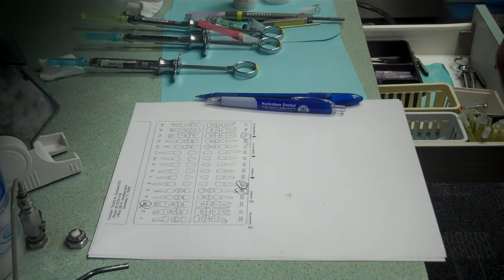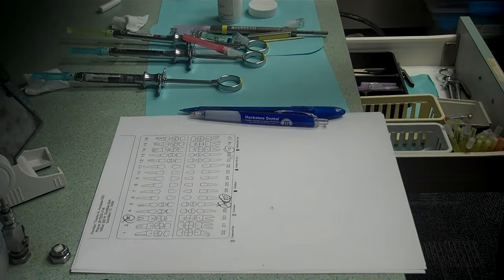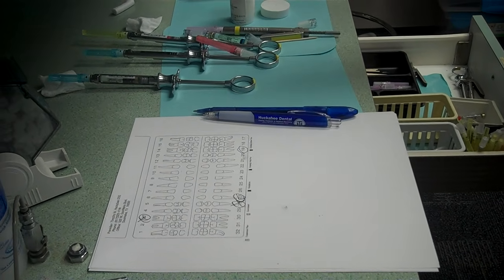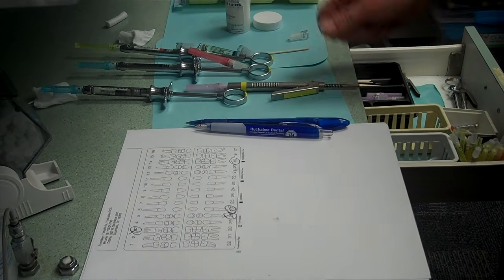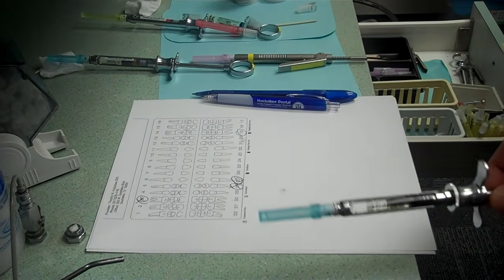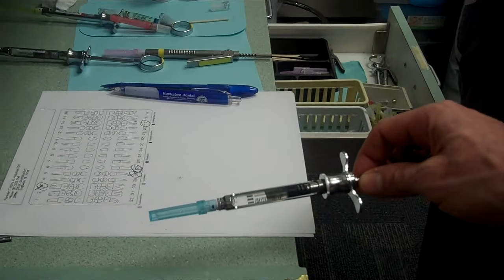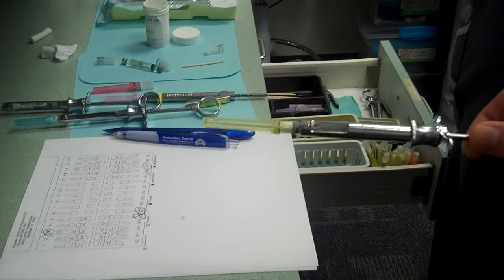Get it. What would we do on that one? On 19, you would do a block, and you'd use blue with Citanest Plain, Lido with yellow, and then you follow up with the purple and Septocaine. That is usually correct. Now, one caveat here, Dr. White usually does not inject with the Citanest Plain for his blocks. He will go directly straight with this. So that's one of the differences that we do.